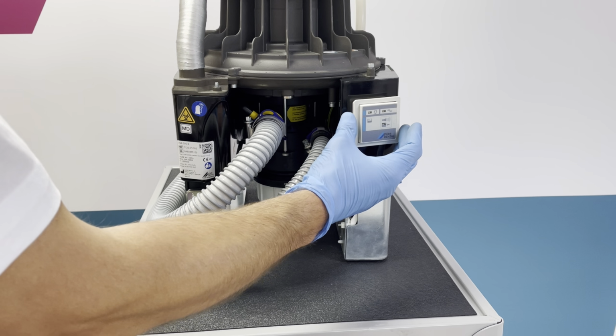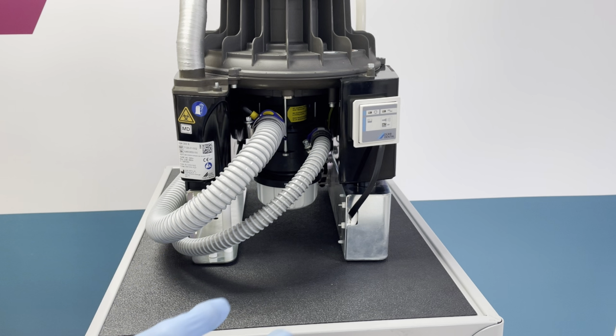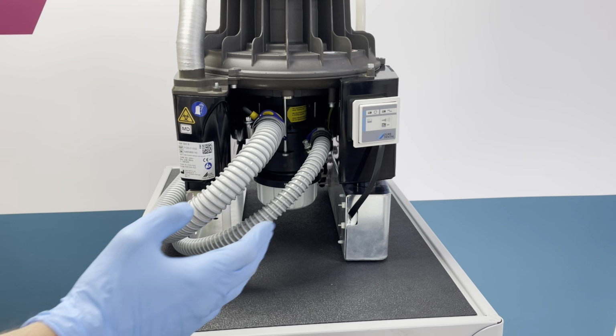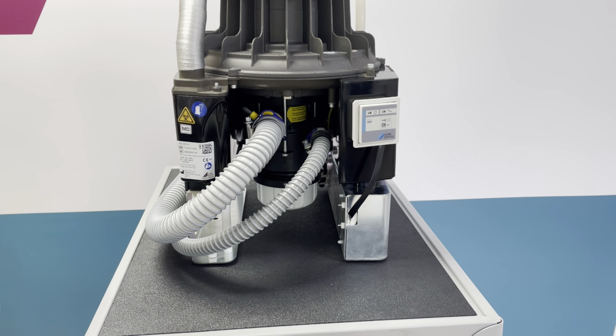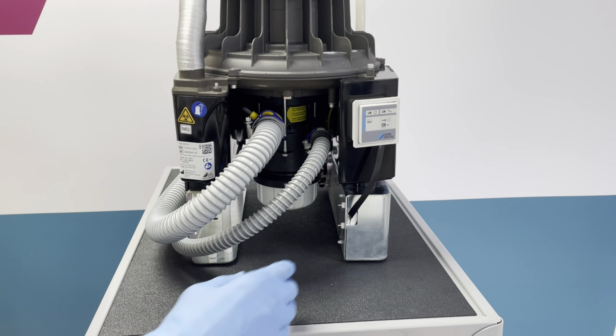So when the 95% alarm is displayed, if you're halfway through a patient, say, you can press this button once and it will silence the alarm, so you can carry on treatment without the annoyance of listening to the beeping noise. But once it reaches 100% full, the machine will stop and it will not start again until you perform the adequate maintenance on the pot.